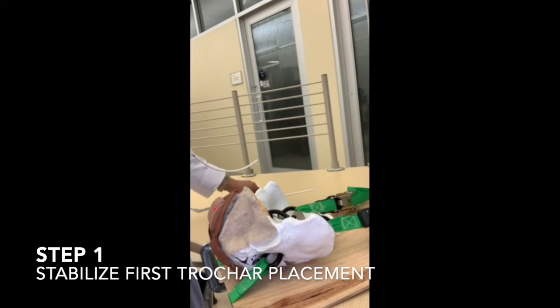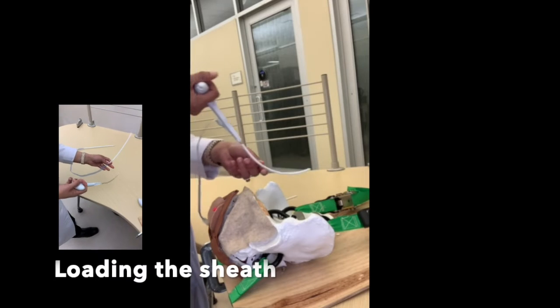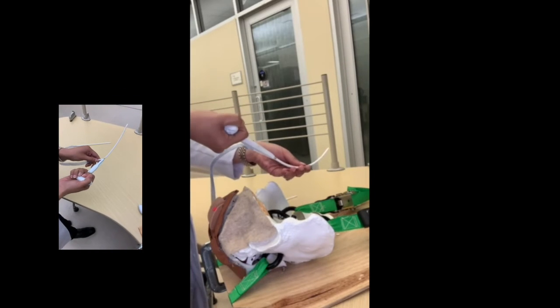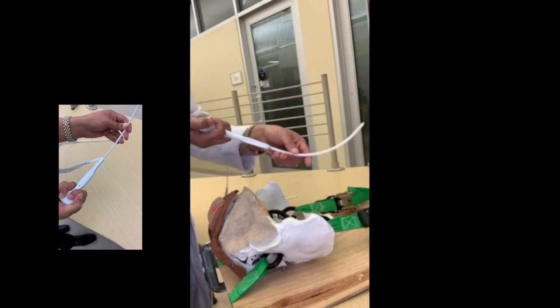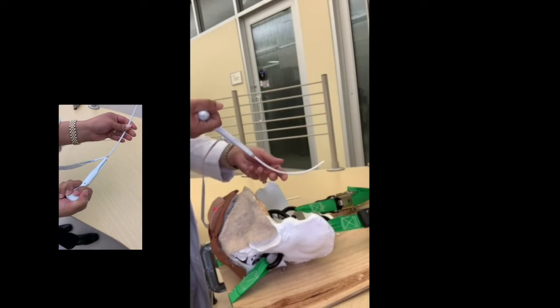So we will start on the right side of the patient with the urethra and the bladder deviated to the opposite side, holding the TVT on top with a proper grip to avoid having the tissues try and push your hand sideways, so you're in full control. So we'll start by going into the right tunnel of the dissection. Throughout the insertion, your index finger of your non-dominant hand is pinching the tip of the trocar between the patient and your finger. So you're holding it tight and guiding it, making sure you're not perforating through the vaginal tissue.